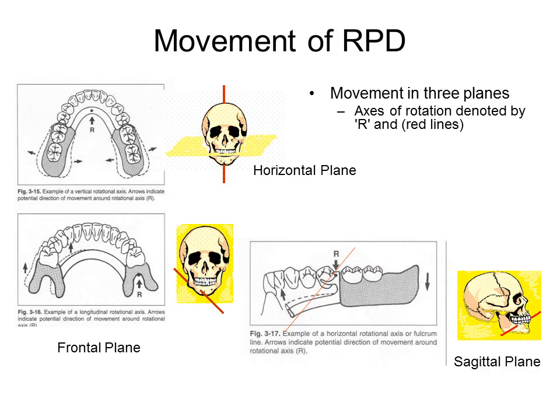An understanding of these three basic movements can simplify the study of partial dentures. The partial denture occupies a dynamic environment under the influence of the structures of the oral cavity. The first movement in the horizontal plane is referred to as fishtailing. Buccolingual movement of the partial denture is both traumatic to the abutment teeth as well as the residual ridge. Stabilizing components may be added to the partial denture to resist this type of movement.